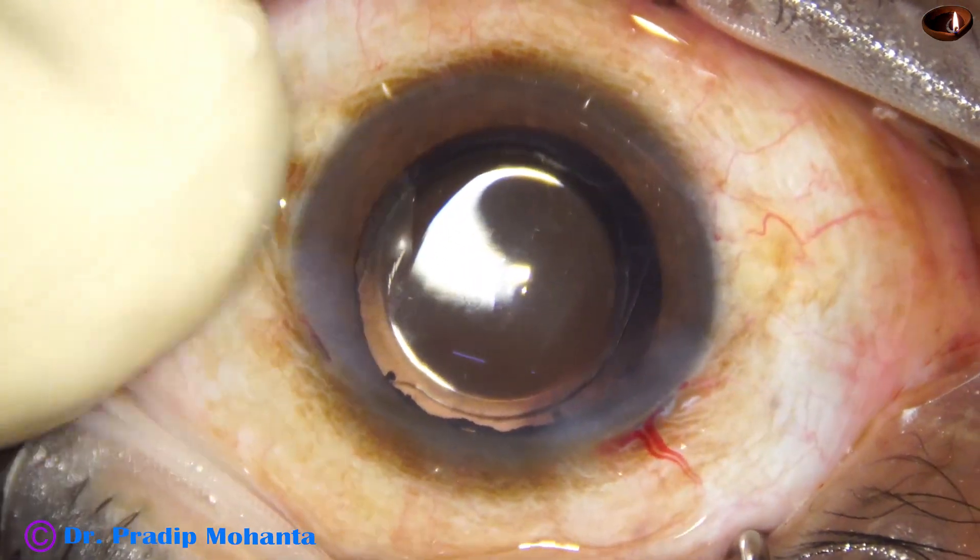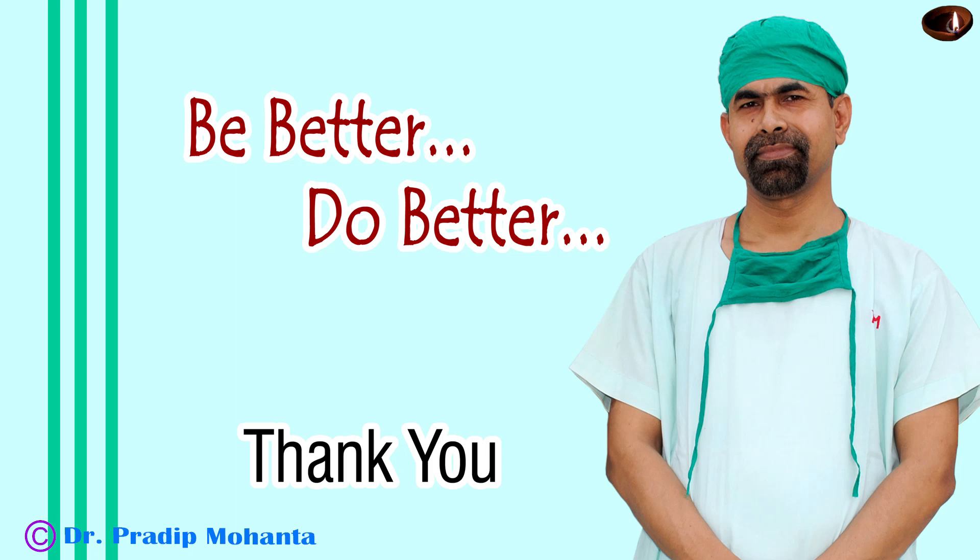The integrity of the wounds is checked — there should not be any leakage from any site, and the case is concluded. Thank you very much for your attention. I hope this video will help you in developing your surgical skills and encourage you to try the submarine chop technique. Since the phaco tip is within the substance of the nucleus, whatever ultrasonic energy is applied stays within the nucleus, keeping the cornea crystal clear the next day.